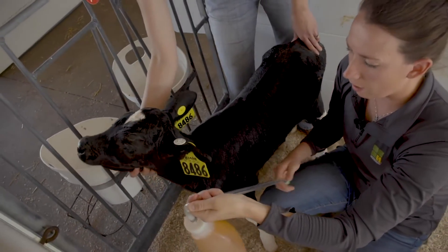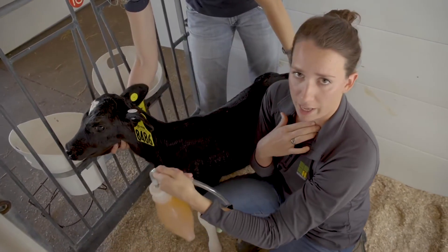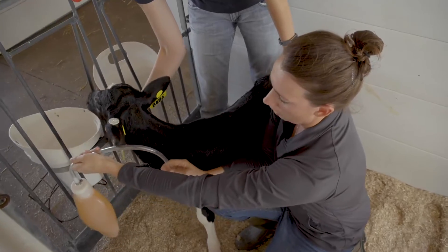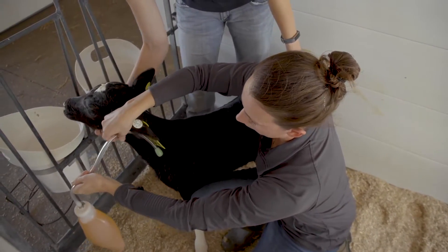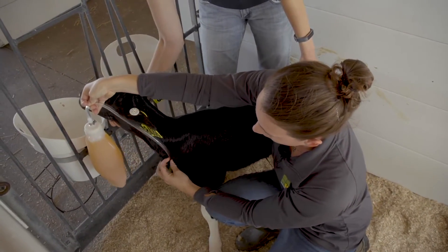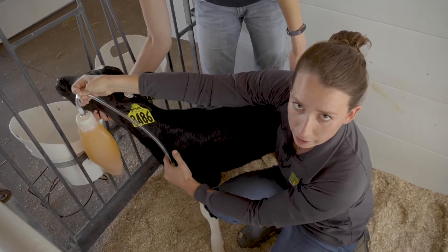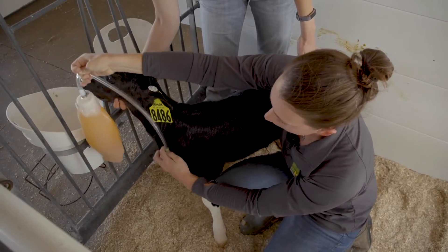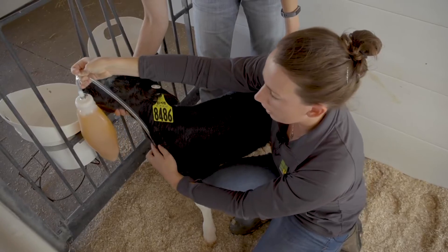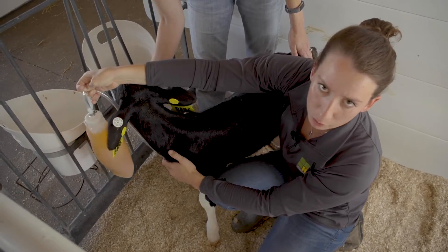When feeding with an esophageal tube, slowly push it in on the left side of the mouth. The esophagus of a calf is on the left side; the trachea is on the right side, so we want to make sure the green ball of the tube stays on the left side. Once it's in the mouth, follow it down the left side of the esophagus. Once the tube is in, you can feel the green ball right on the chest — moving it up and down confirms it is in the esophagus and not the trachea. At that point, lift the bucket or bottle and the electrolytes will flow into the stomach of the animal.